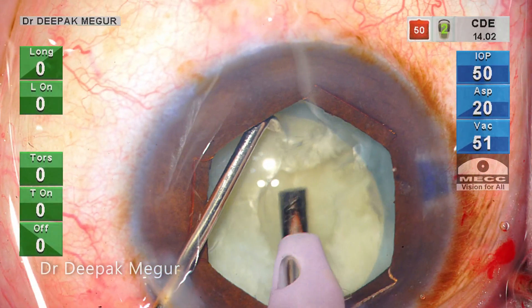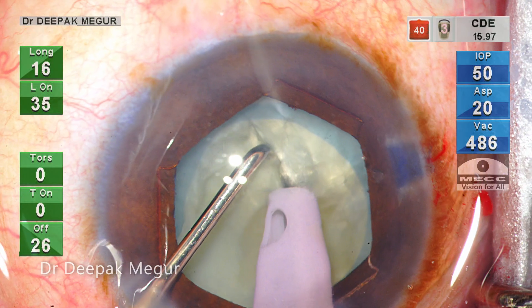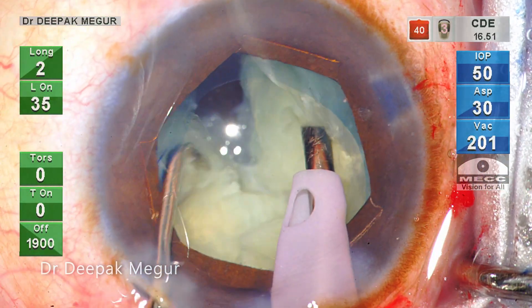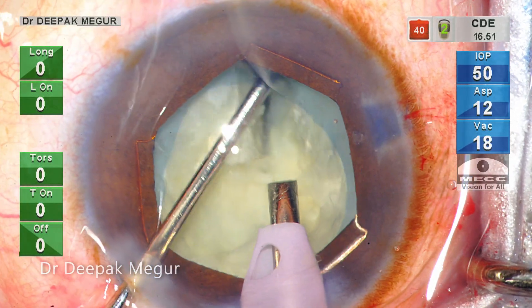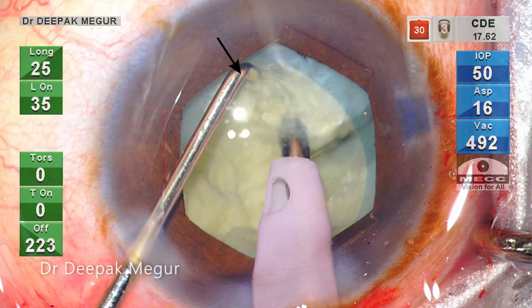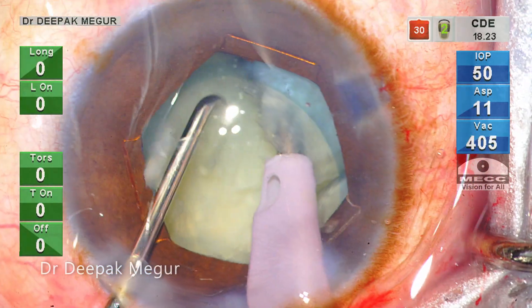The separation, mind you, is not through and through, so I need to do it once again. I gently rotate the nucleus and the second chop is performed. The nucleus is mobile because of the lack of the epinucleus and the underlying cortex, hence stabilizing the nucleus while chopping is becoming tricky.